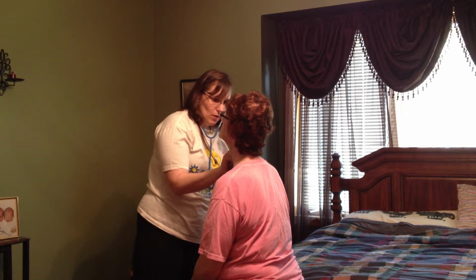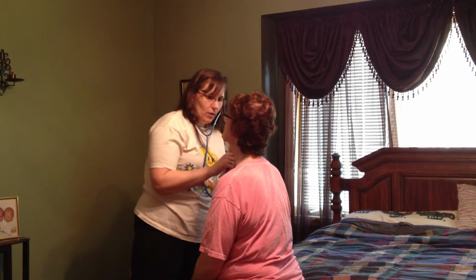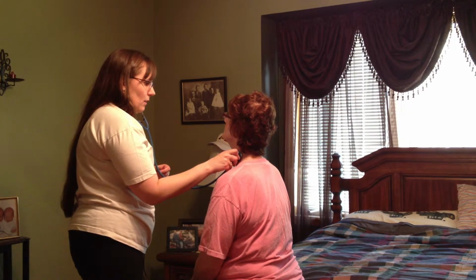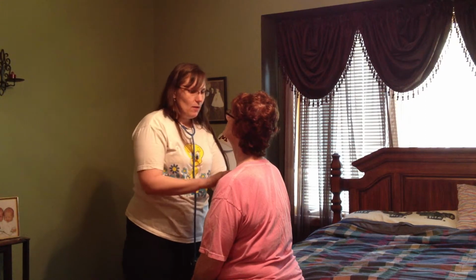I'm going to auscultate for the carotid pulse. I'll have you take a deep breath. Hold it. 1, 2, exhale. Listening for any turbulence. That would be called a bruit. And I'm going to listen to the right side as well, and then I want to compare it. Okay. And then I'm going to palpate for any crepitus.